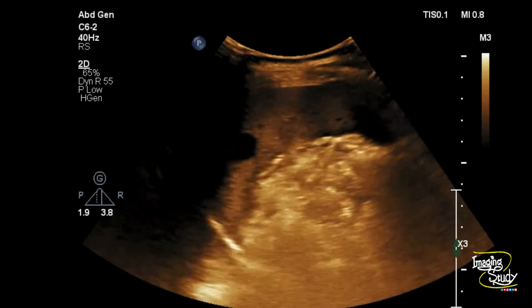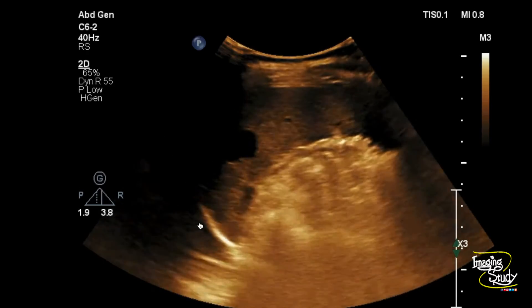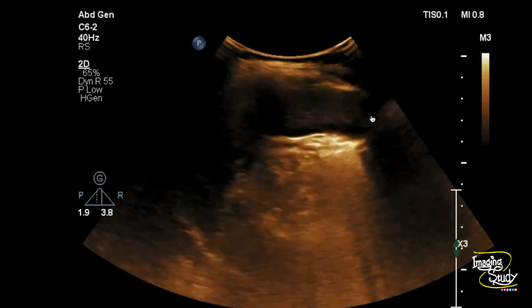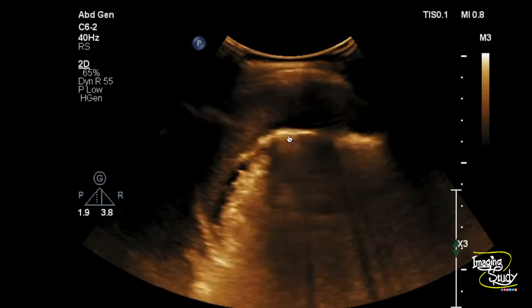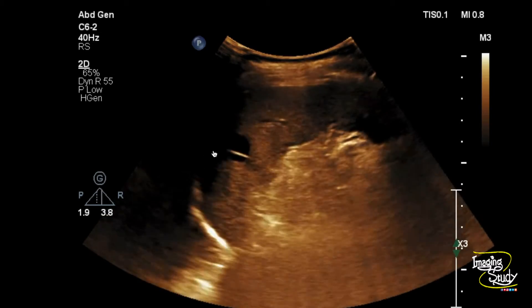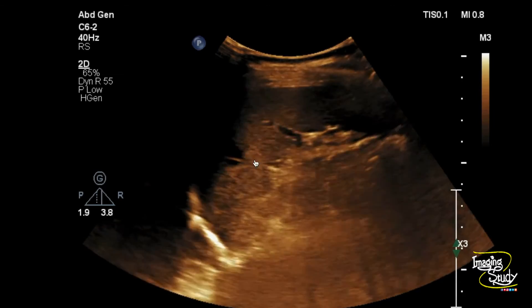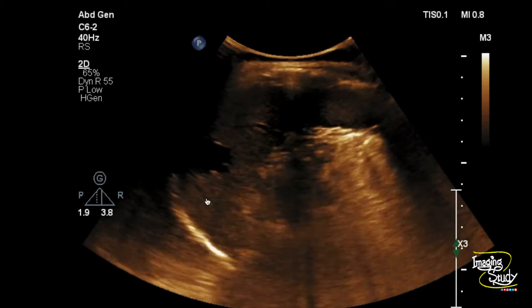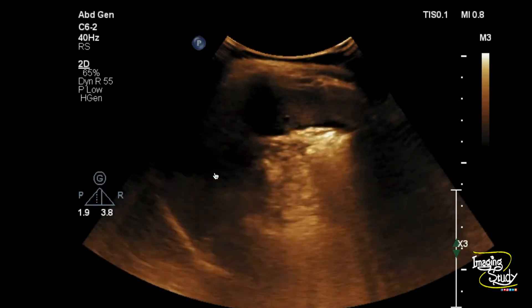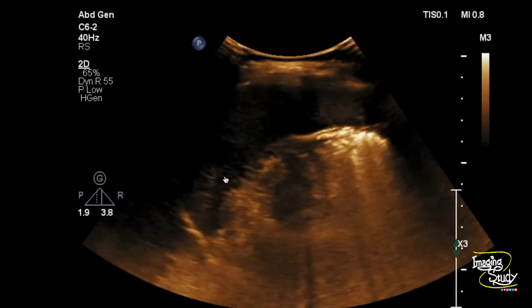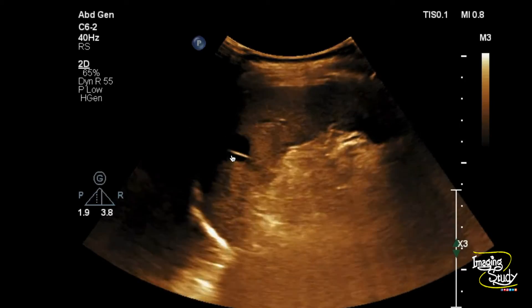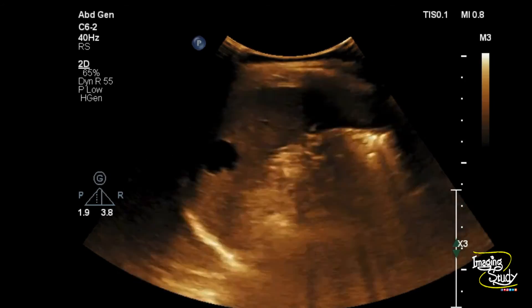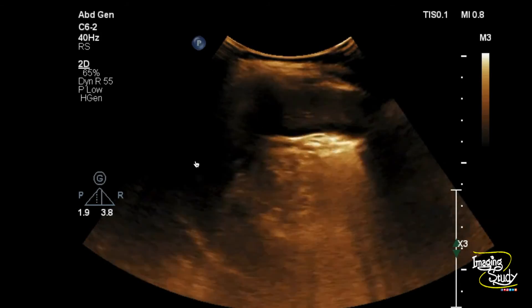Here you can see the longitudinal section of the spleen. This is the diaphragm, so this is the upper pole, and below the diaphragm, this is the lower pole. At the mid, this is the hilar region. If you check carefully, you can see a well-defined round anechoic cystic structure within the splenic parenchyma. You can see the posterior acoustic enhancement. There is a thin echogenic septation within the cystic lesion. The surrounding architecture is completely preserved, with no wall thickening or surrounding edema.